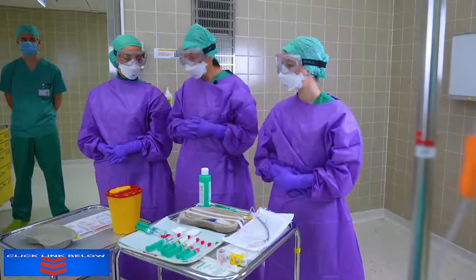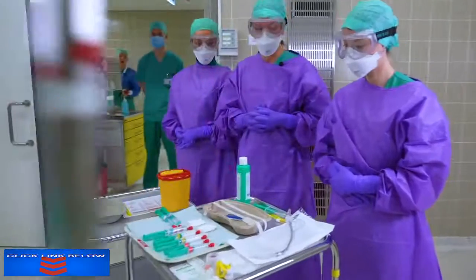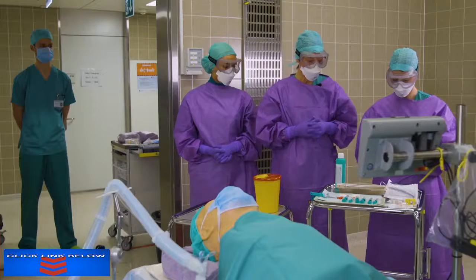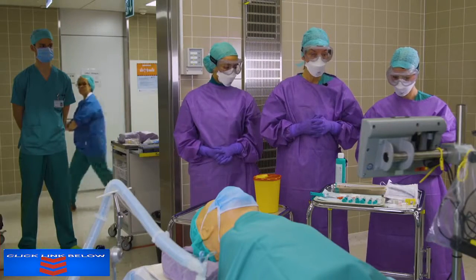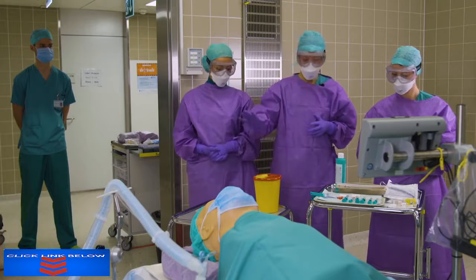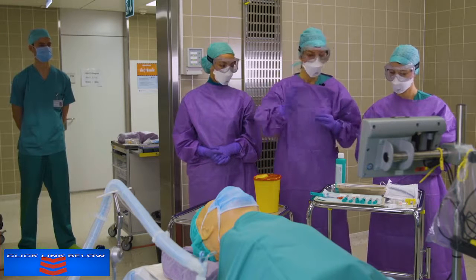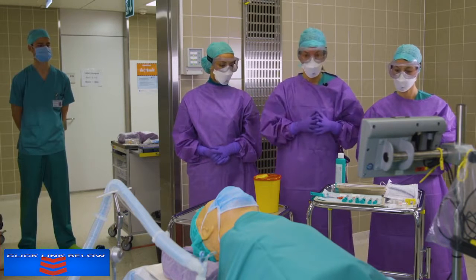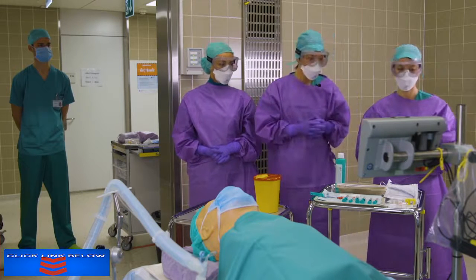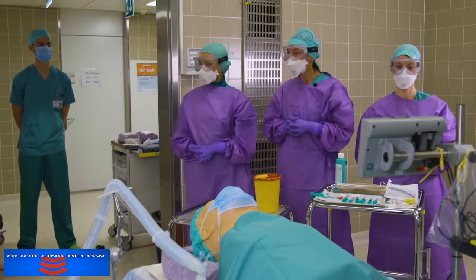For induction, we have our medications on the tray, as well as our airway materials, including an endotracheal tube with a stylet in place, as well as our video laryngoscope. Next to the induction table, we have our dirty tray for dirty materials to be disposed there. It's also important to have a trash bin next to the patient so you can drop dirty articles right into the trash bin. Outside, we have Tim, who is our clean person and jumper. In case we need medications or airway material, he will be able to hand them to us.